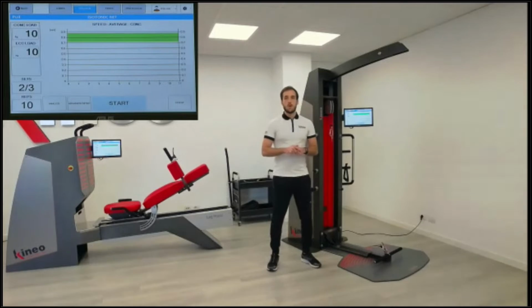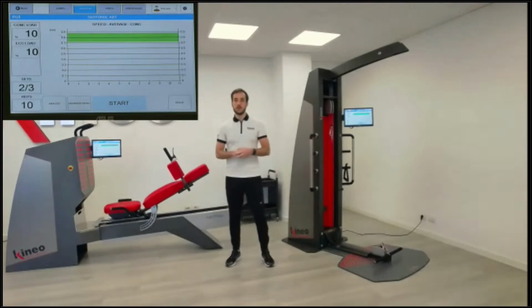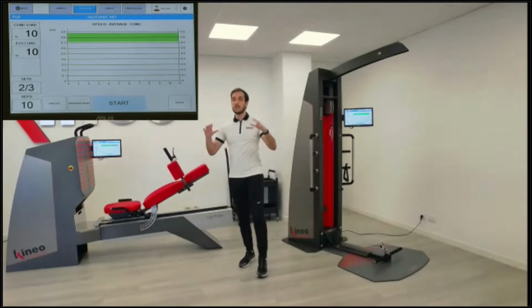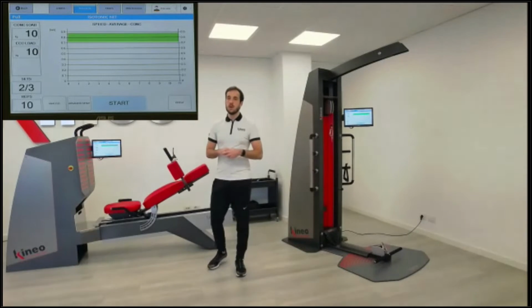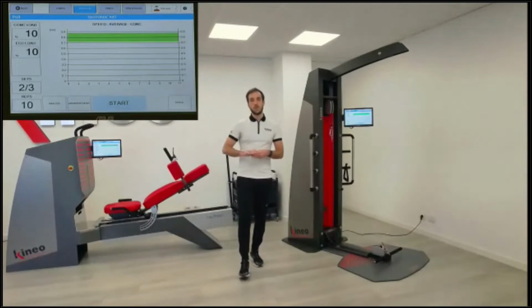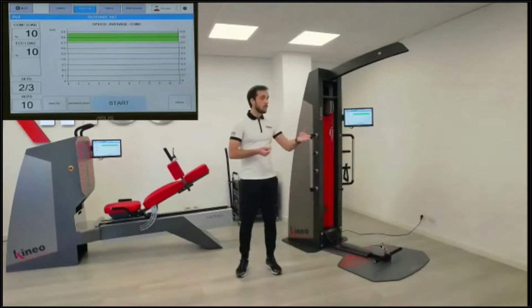All right. So basically here, what will you see? You will see different types of models here. Here there is the pulley squat, which is made by the squat platform and the pulley, and this is an accessory for the lat machine exercises and all the cable exercises for an upper position. And here you see the leg press, which we'll try later. Then Damiano, please.